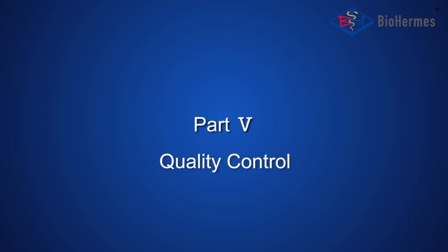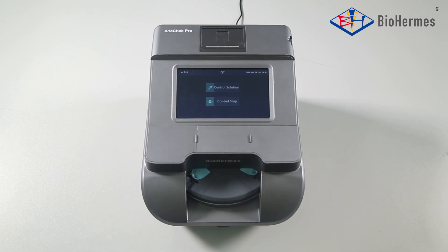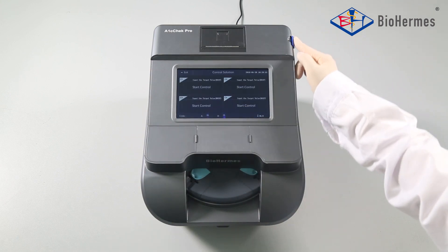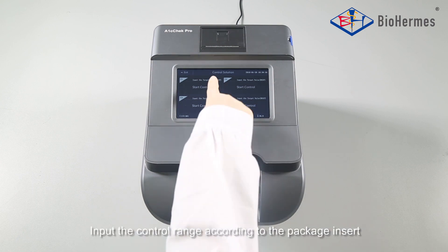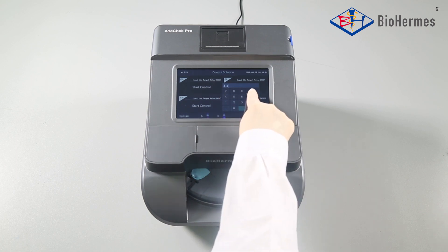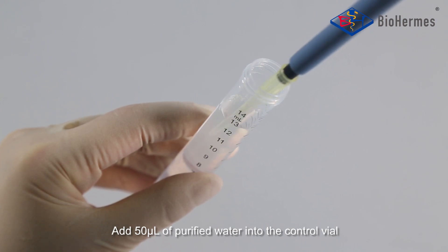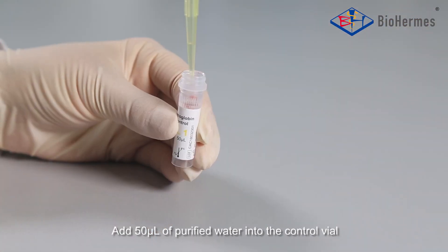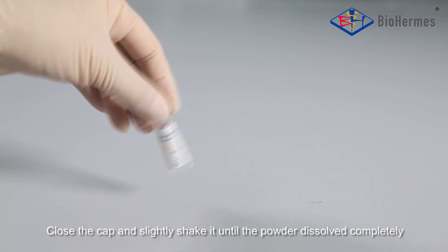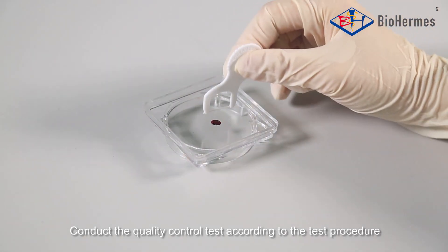Part 5: Quality Control. Press the QC icon, then press the Control Solution icon. Input the control range according to the package insert. Add 50 microliters of purified water into the control vial. Close the cap and slightly shake it until the powder is dissolved completely. Conduct the quality control test according to the test procedure.